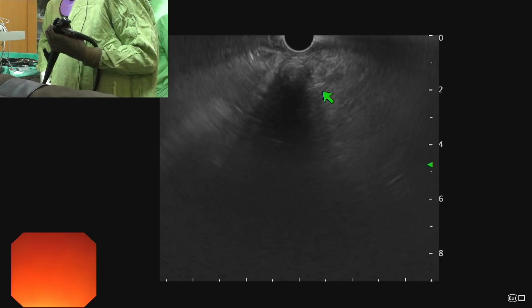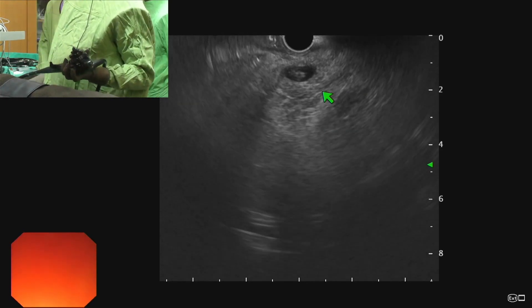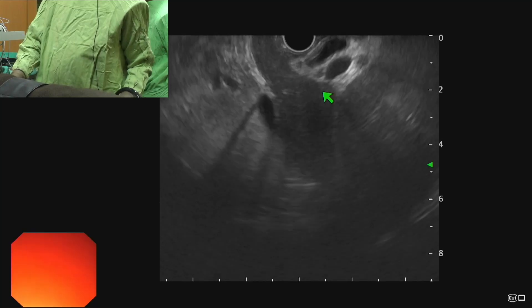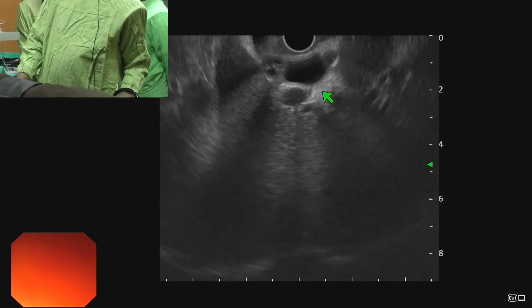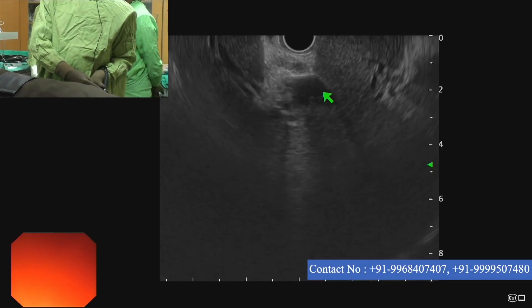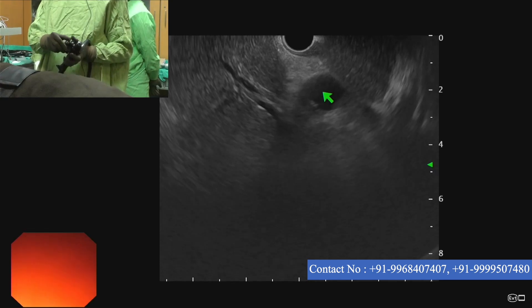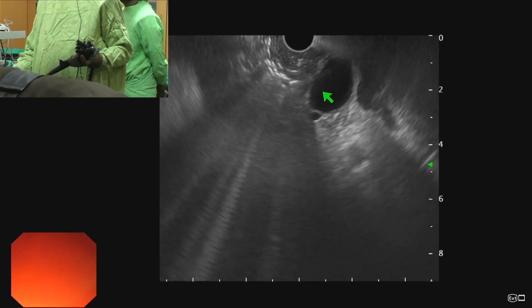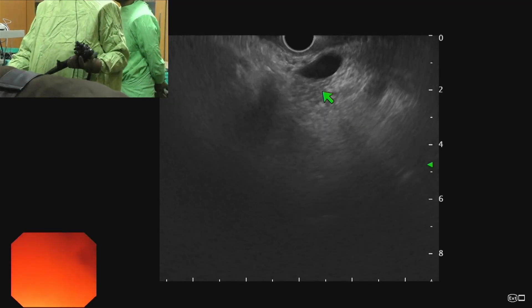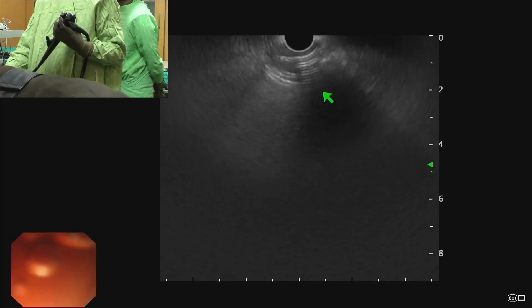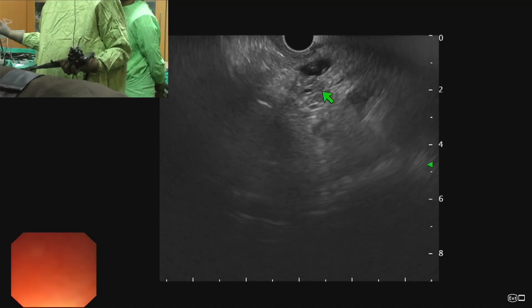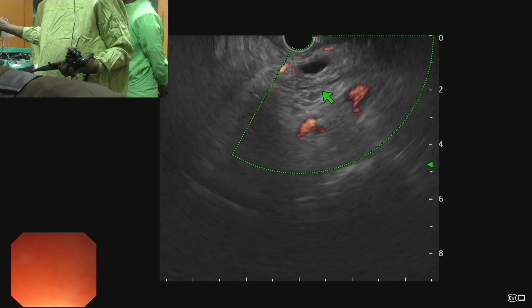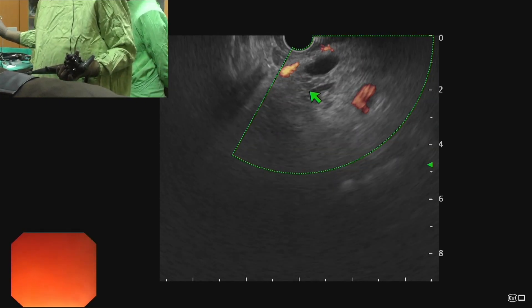Here we can see a stone measuring 10 mm. If I rotate scope anticlockwise and drop my left hand, we can trace the bile duct into the liver and see this duct is dividing — confirming it's the bile duct. Rotating clockwise and slightly pushing inside while raising the left hand, we should be able to trace the duct towards the ampulla. At the lower end we can see the pancreatic duct as well — that duct is the bile duct and that duct is the pancreatic duct.